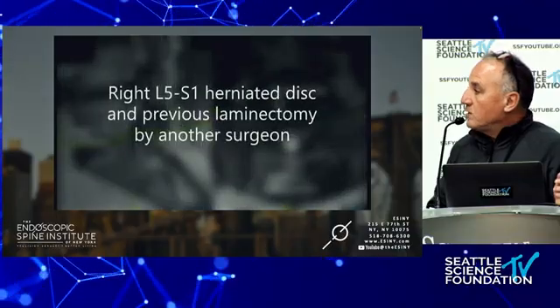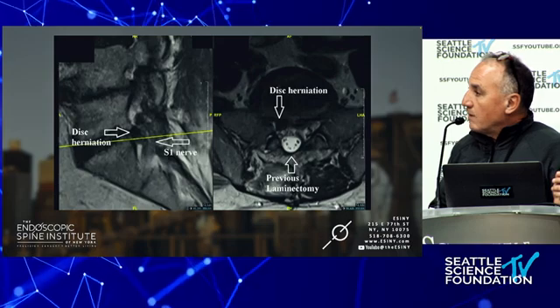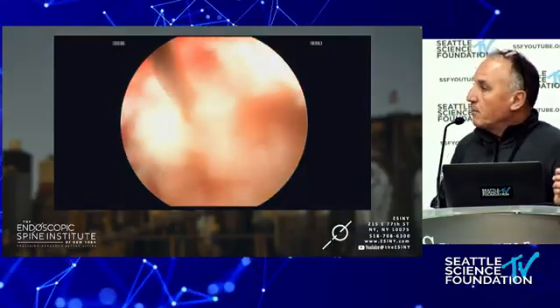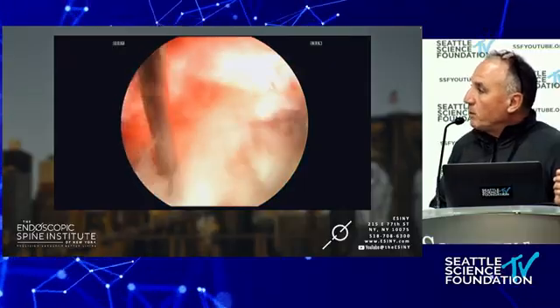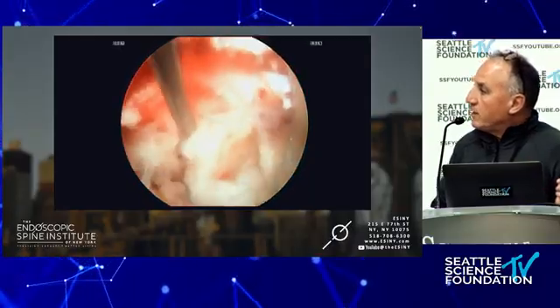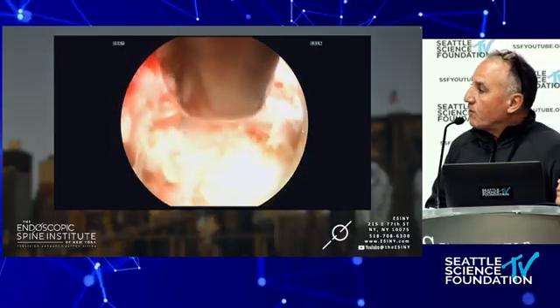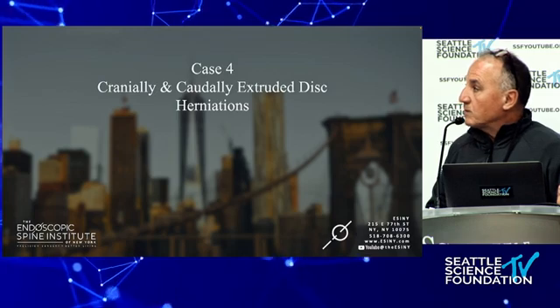Disc re-herniation: this is a patient who had a laminectomy at Harvard and has a disc herniation. This is one of the superpowers of transforaminal endoscopic spine surgery, because you're going through virgin territory. Here is a terrible disc herniation — this patient sends me so many referrals. This disc herniation is sitting underneath the S1 nerve root. I'm going to put a ball probe underneath the S1 nerve root, break that scar tissue to free up the disc herniation, and then remove this large chunk of disc.